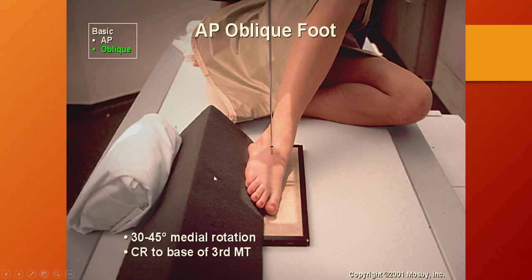Sponges can be used in this with a sandbag to hold it in place if your patient is having a difficult time rotating their foot.